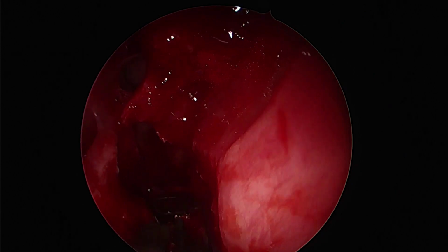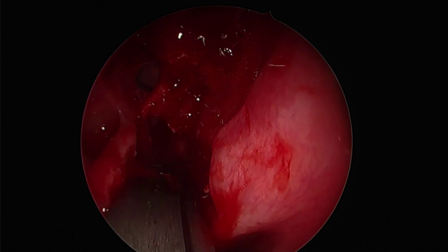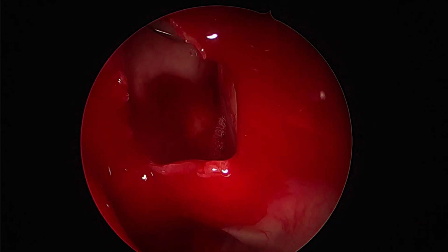The Hackett-Koffler bone punch is a wonderful instrument for all this work, because one can clearly palpate the bone which has to be dissected and remove it in a backward manner.